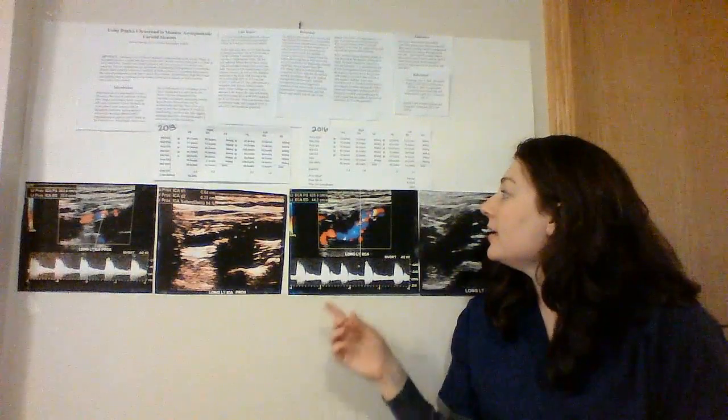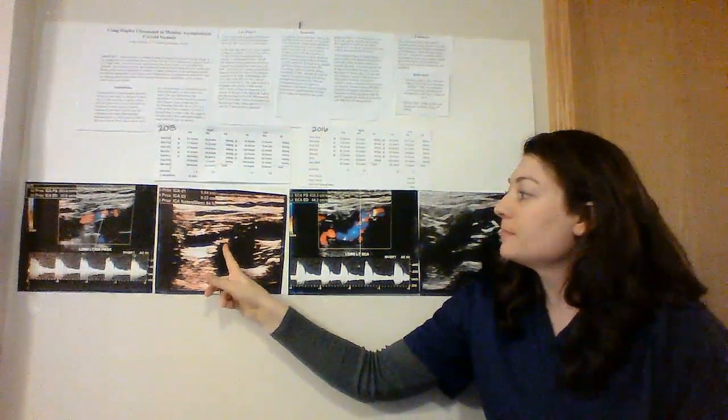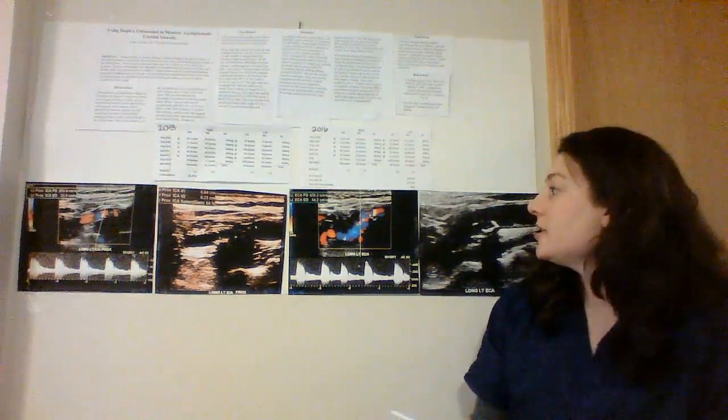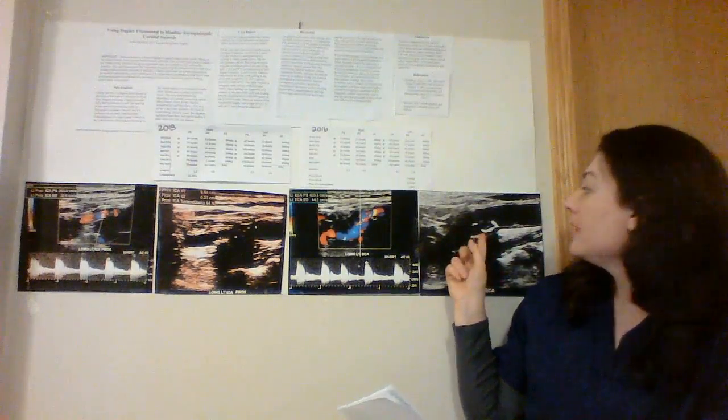The left side indicates intimal thickening in the CCA, with hyperechoic irregular plaque in the proximal ICA measuring at a 64% stenosis. There is a high peak systolic velocity of 242.9, making the left peak systolic ICA-CCA ratio at a 4.7. The left proximal ECA also has the highest peak systolic velocity of 435.3 due to the heterogeneous irregular plaque in the proximal ECA.